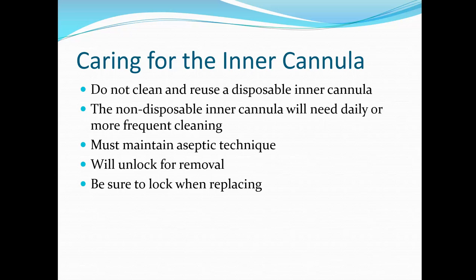The non-disposable inner cannula will need daily or more frequent cleanings if indicated. And we must maintain aseptic technique. You will unlock the inner cannula, and there's a picture of this on the next slide, to remove it, and then be sure to lock it back when replacing it so it doesn't start to come out.